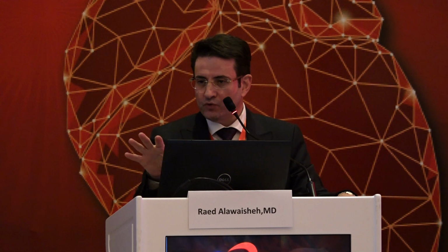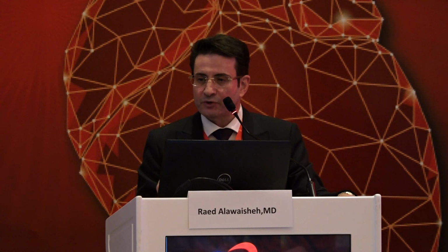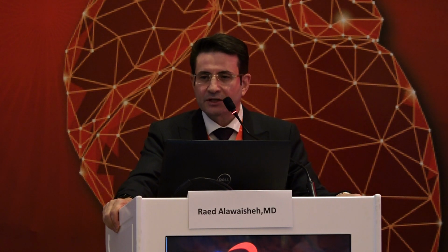So going in the two directions easily without any resistance, with the hydrophilic wire, means that I'm in the true lumen, because there is no way to have the wire freely moving in the two directions unless you are really in the true lumen. I agree with you 100%. Using intravascular imaging is an essential thing in CTO, at every step. Sure, I agree with you 100%. But sometimes, when everything is there, maybe I can skip that. Sorry. Any comment or question?